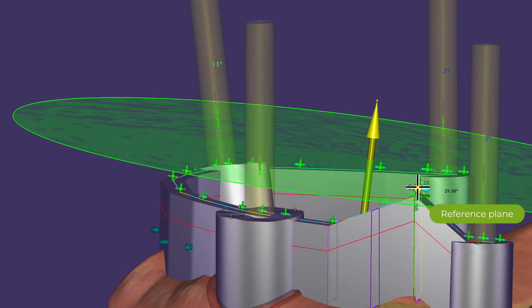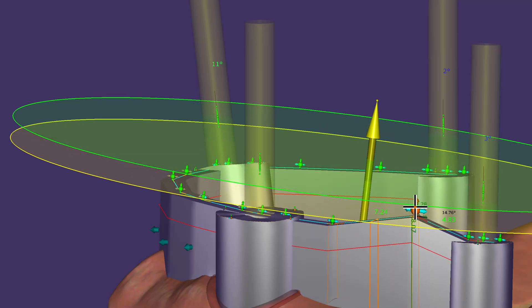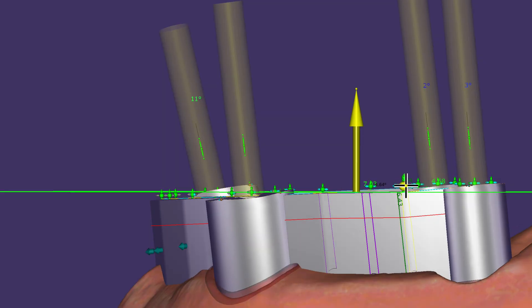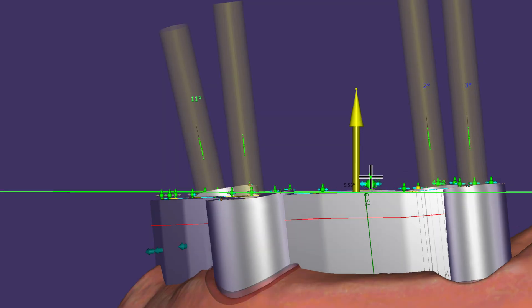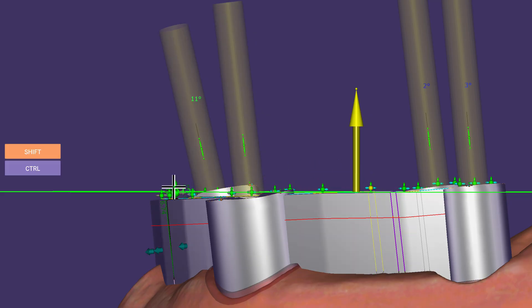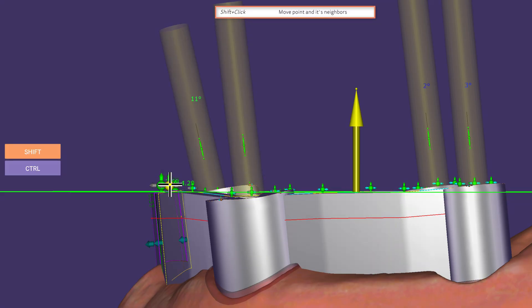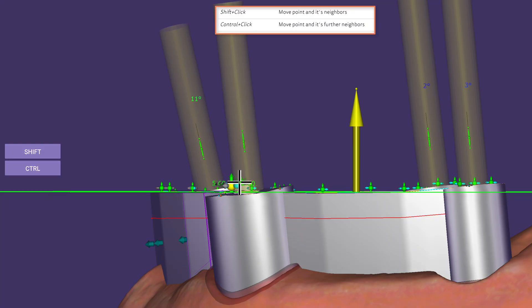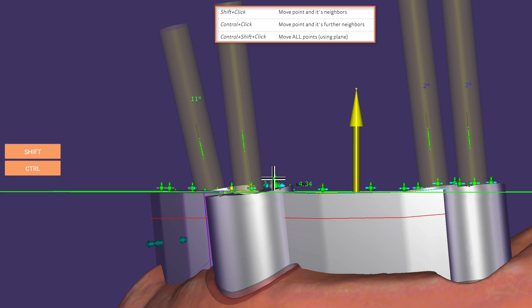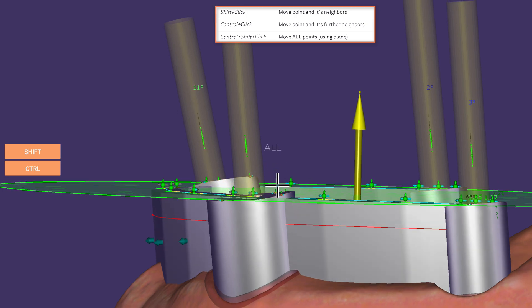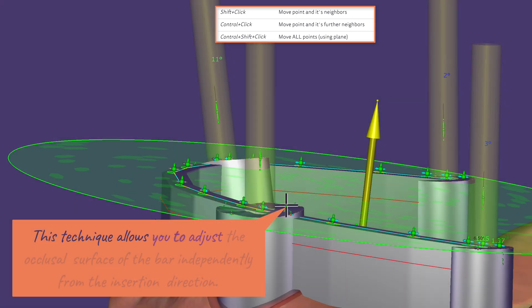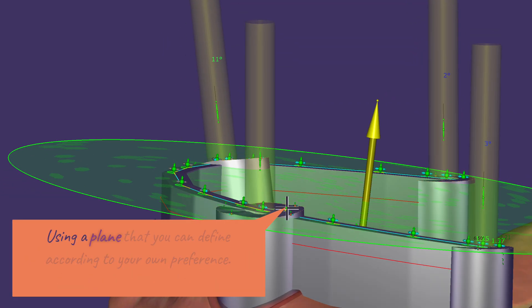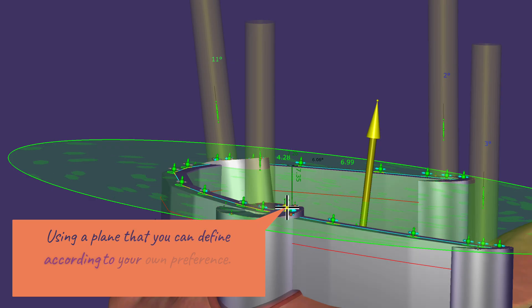Again, the reference plane jumps to the control point defined with a double click. With a single left click on any of the upward arrows, the point immediately jumps onto the reference plane. By holding CTRL or SHIFT while clicking, one or two neighboring control points on each side are also attached to the reference plane. CTRL+SHIFT combined levels the whole bar top at once. This technique lets you adjust the occlusal surface of the bar independently from the insertion direction, using a plane defined according to your own preference.